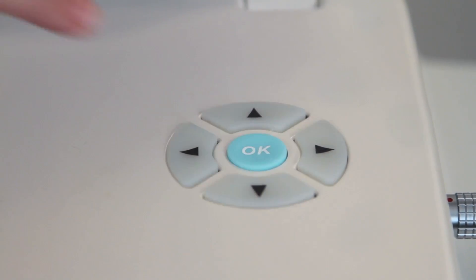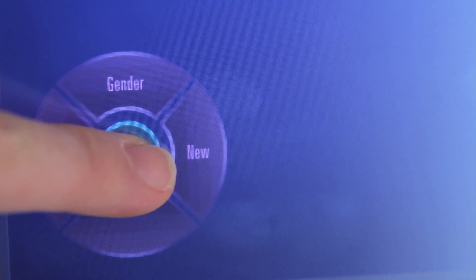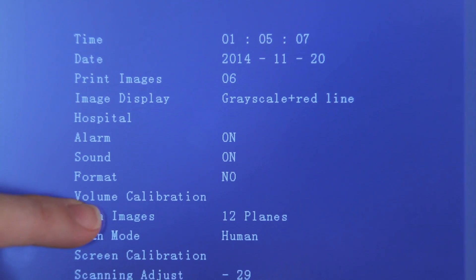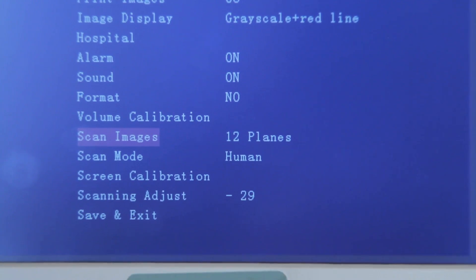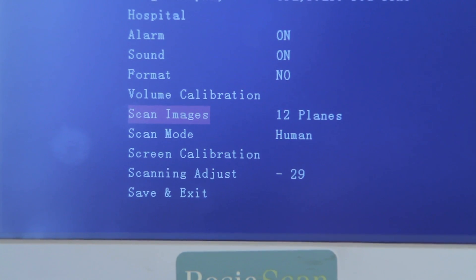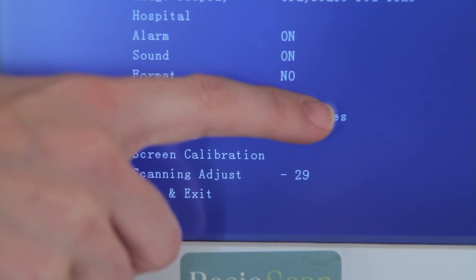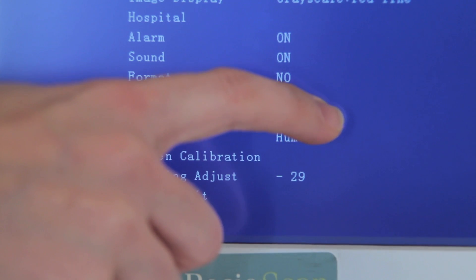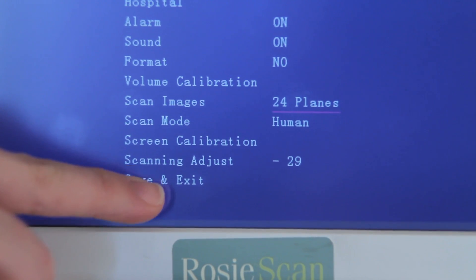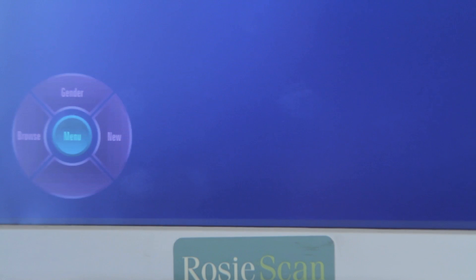Press the OK button on the control panel or touch the Menu functional key to enter the system settings screen. You can touch the screen to select features you need to change or use the directional keys on the control panel. For example, touch Scan Images to choose between scanning 12 or 24 images. You must click Save & Exit in order to save your changes and go to the pre-scan screen.